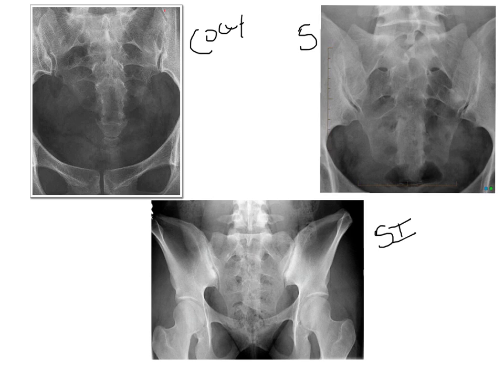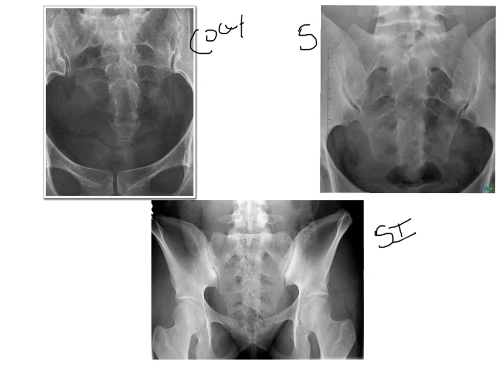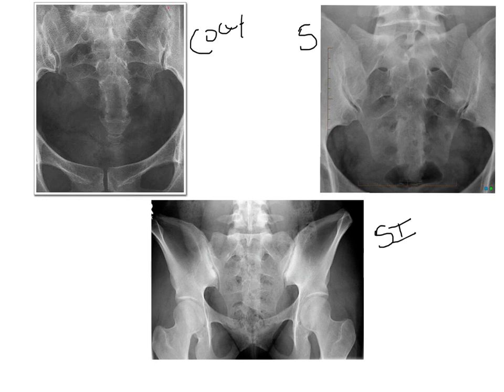Now, we talked about angulation briefly, that it was tail to tail, so we're angling caudal. But how do we know whether we gave it the right amount of angulation? Well, you should be able to see, we're still talking about the coccyx. There it is. Let me get my little pen. We should still be able to see some open joint spaces within the coccyx structure. That indicates that we have the correct angulation for this projection. If these appear closed, then we are looking at a problem of not enough angulation.